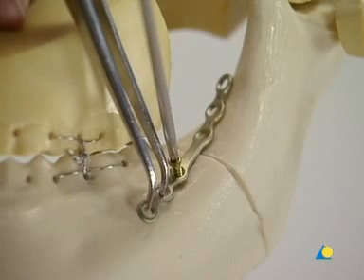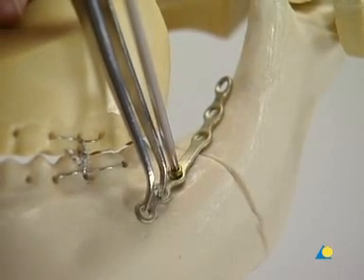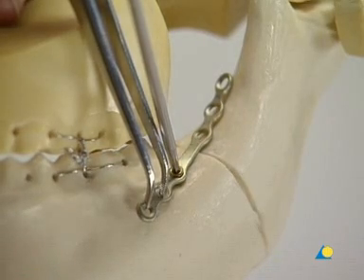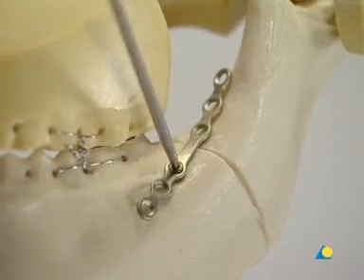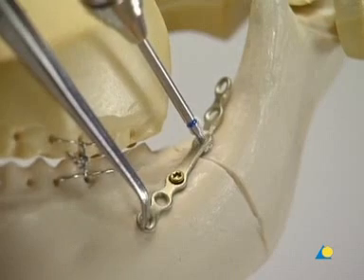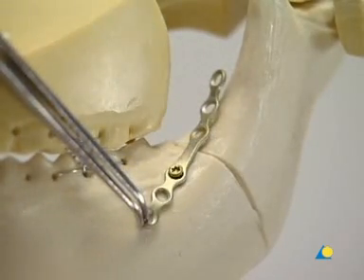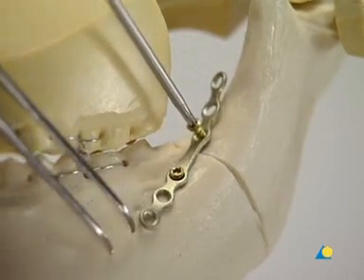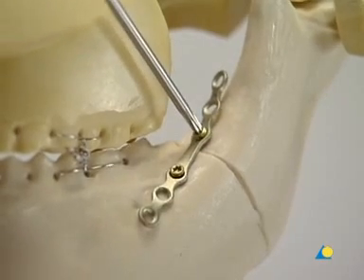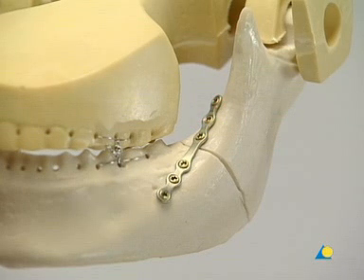A 6 mm long, 2 mm screw is inserted but not fully tightened, to allow for any plate adjustment. It's also possible to place the first screw into the proximal fragment, to allow for reduction of the condyle-bearing fragment with the help of the plate. Another hole is drilled on the other side of the fracture line. The second 2 mm screw is inserted. The remaining plate holes are filled with screws and they are all fully tightened.